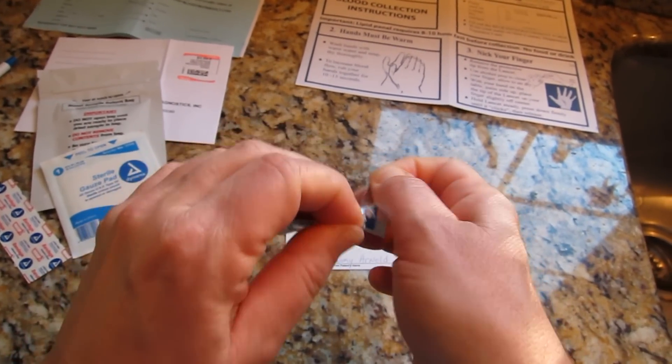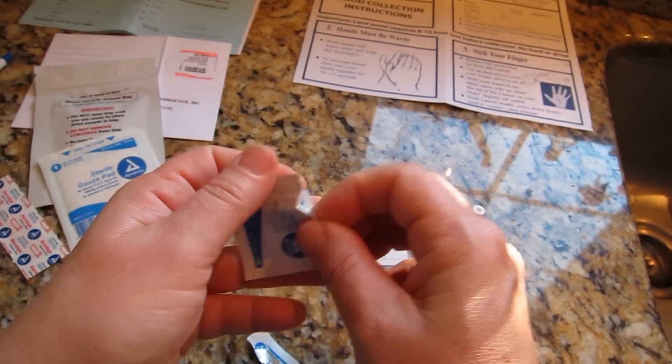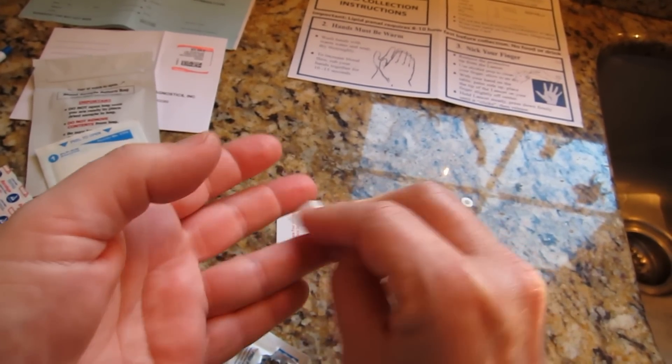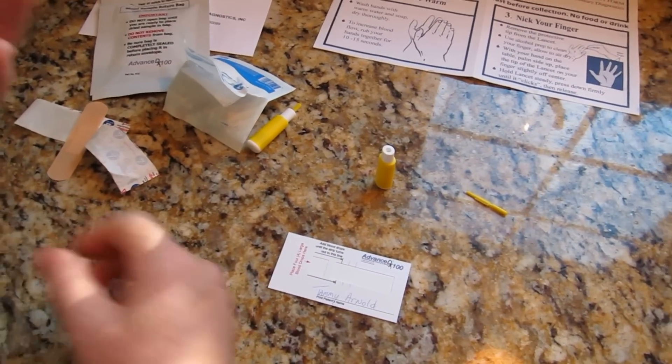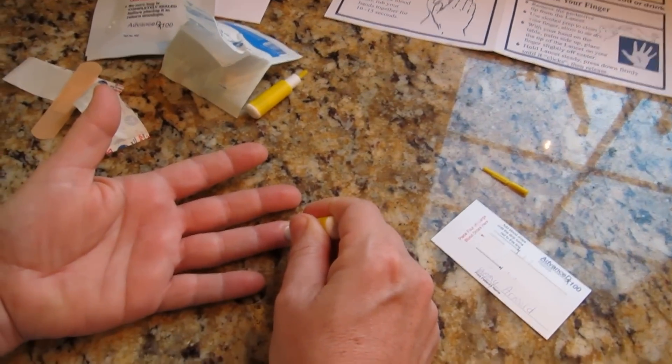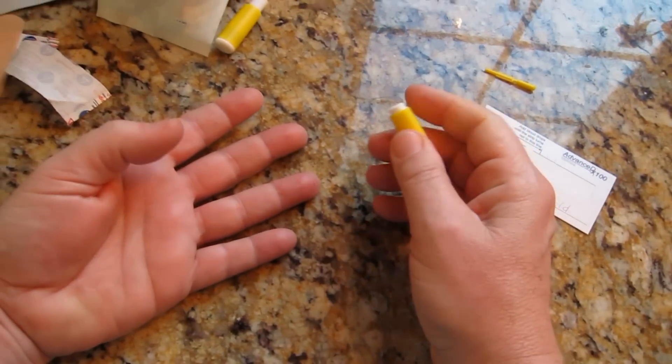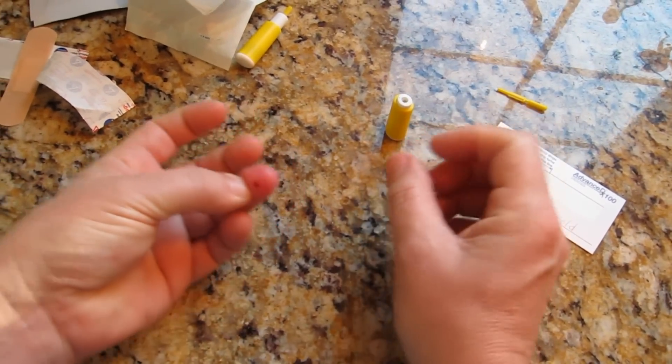Open the alcohol prep pad to clean the finger that you will be pricking with the lancet. Clean the tip of your finger well and allow it to air dry. Lay your hand on the table palm side up. Place the tip of the lancet on your finger slightly off-center, hold it steady, and press down firmly until it clicks, then release.